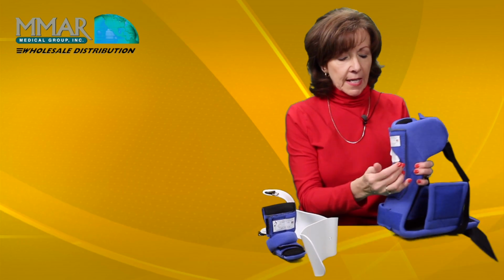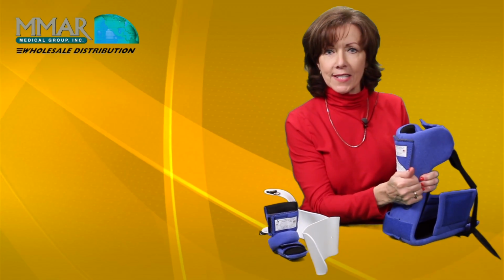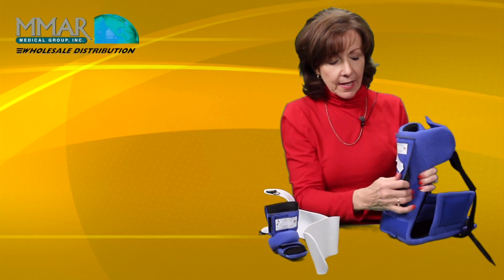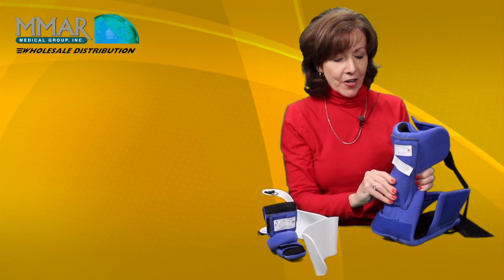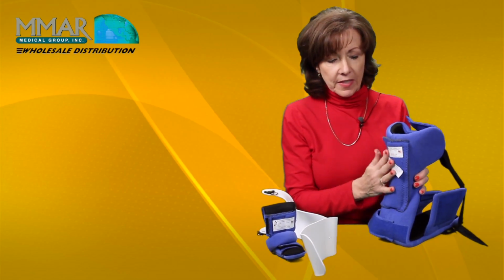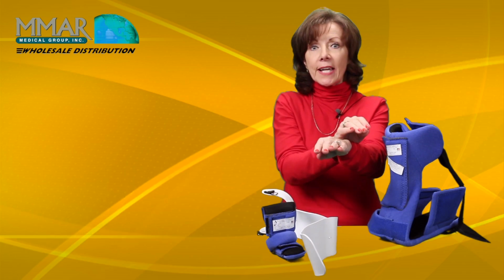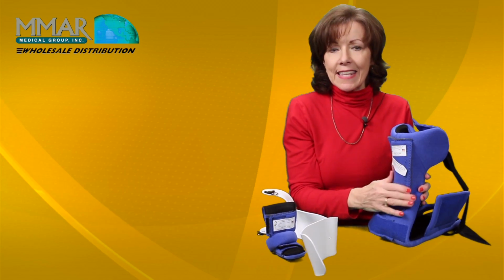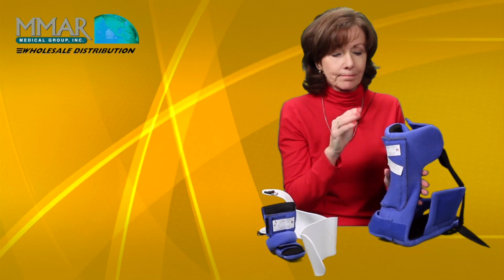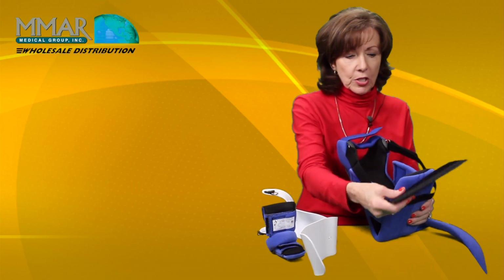Now we started putting labels on the rotator bar cover because people didn't always look to see that there is a rotator bar here. You simply open that up, put it back, or you open this side up, or put it back. The reason for this is if you're not using the rotator bar, our patients move and they may cross their legs and rub, and we don't want anything that isn't covered, if at all possible, that might hurt the other leg. Many times though, patients who require one boot, if they're a contracture patient, they may require two.